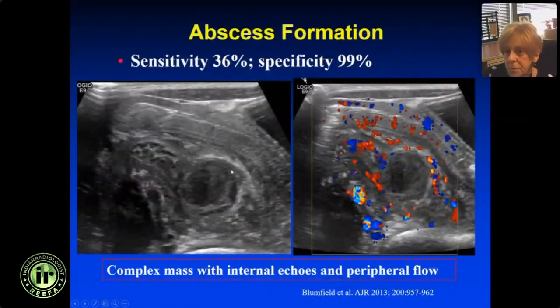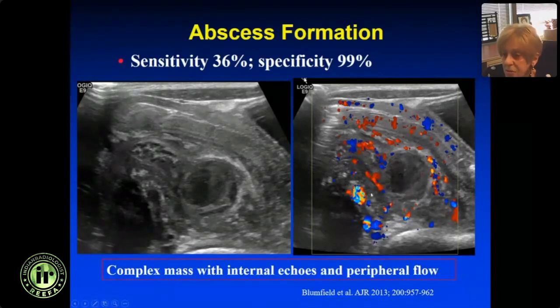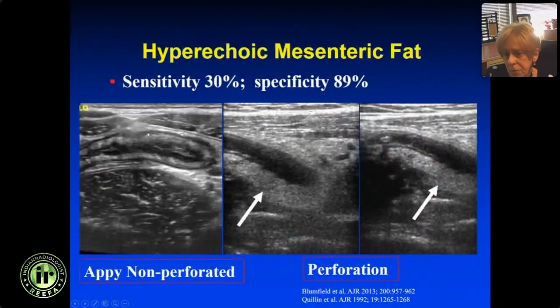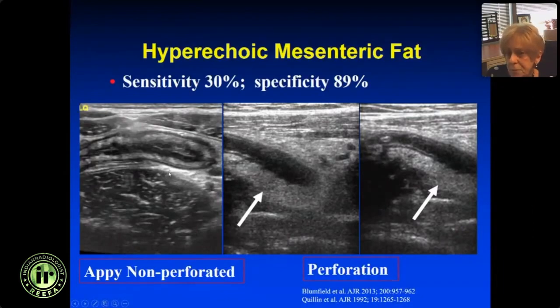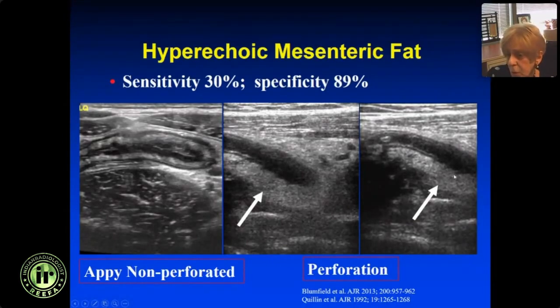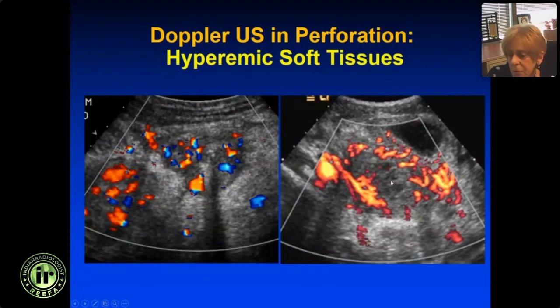An abscess is a sign of perforation. It looks like an abscess anywhere in the body — round, complex mass with scattered internal echoes and lots of flow in the soft tissue. That's perforation. Highly specific for perforation; we see an abscess maybe 35-36% of the time. With perforation, the mesenteric fat gets very echogenic — it's trying to wall off the perforation — and you'll see that in about 30% of cases. Here's an appendix where you've lost the mucosa and there's loss of echogenic fat. Here's another with lots of echogenic fat and an abscess with a lot of flow in the soft tissues.